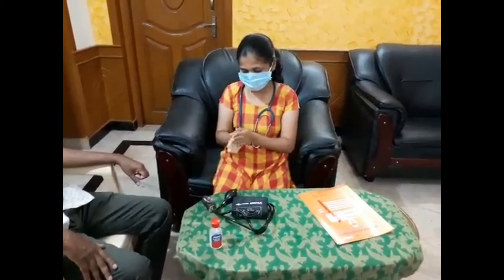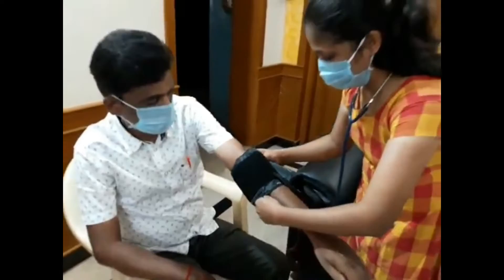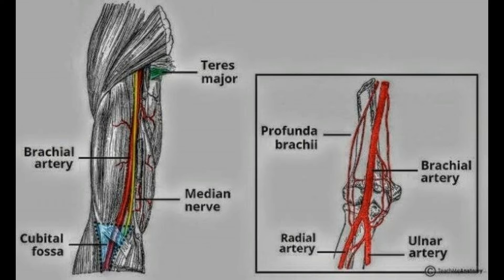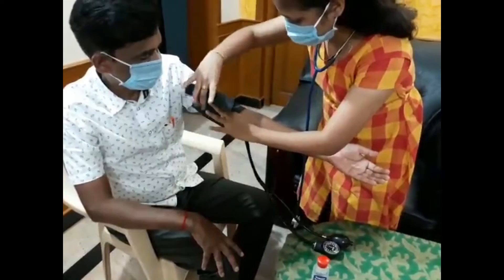The patient should be at rest at least three to five minutes before taking the blood pressure. The cuff should be placed over the patient's arm. Can you show your hand? The cuff should be placed above the elbow crease, two to three centimeters.